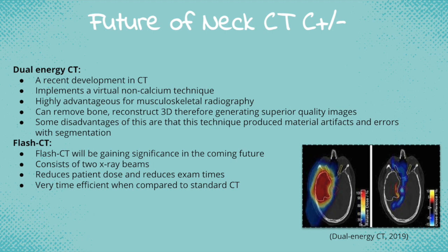Another type of technique that we found to be the future of neck CT was flash CT. The flash CT scanner features 2 X-ray beams, yet it minimizes a patient's exposure to radiation and the time for testing. For example, a traditional CT scan of the chest cavity usually takes about 15 seconds to complete. The flash CT of the chest cavity only lasts about 0.6 seconds, and it captures images of the heart in less than half of a heartbeat, and it exposes the patient to much less radiation.